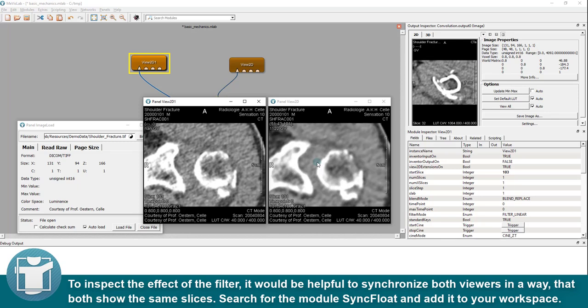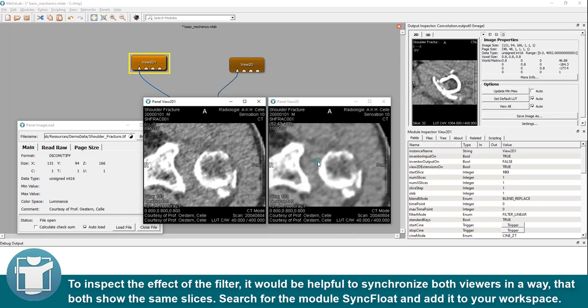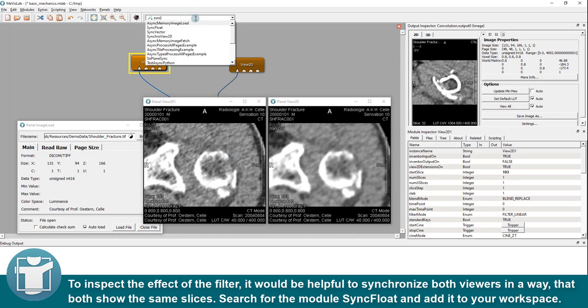To inspect the effect of the filter, it would be helpful to synchronize both viewers in a way that both show the same slices. Search for the module sync float and add it to your workspace.